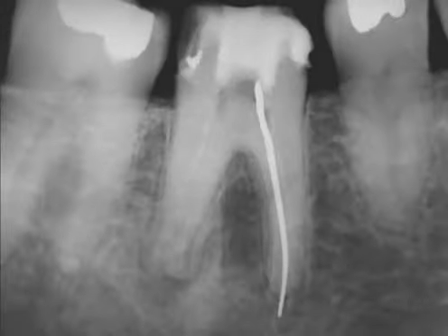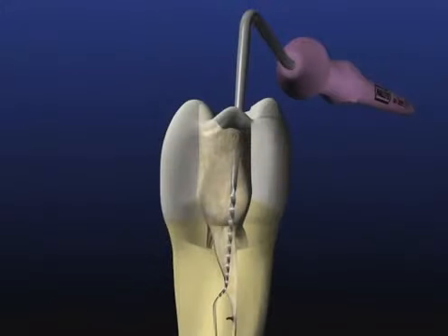You're beginning to see in the case reviews that many of these failing cases have missed canals. Notice the radiograph of a mandibular right first molar reveals a silver point in the mesial root that is coronally foreshortened and apically overextended. As a review, you can begin to see how a micro opener can reach deep into the distal orifice of a mandibular molar and help us get to a more displaced canal.